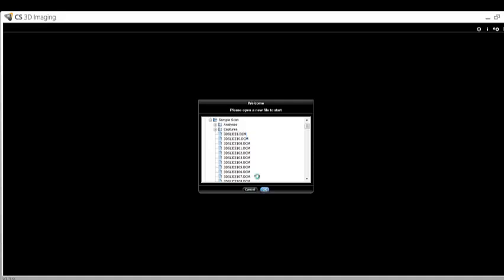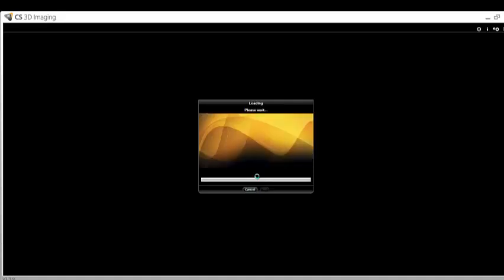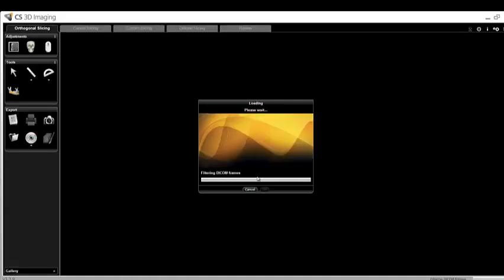You will see the software preparing and rendering the images, and then it will open up into your patient's full scan.